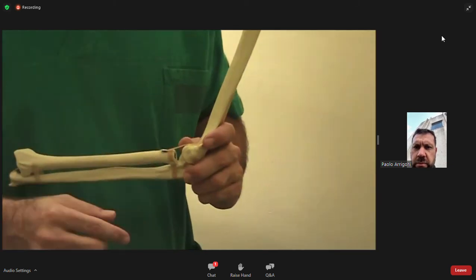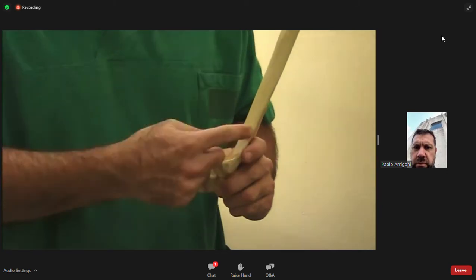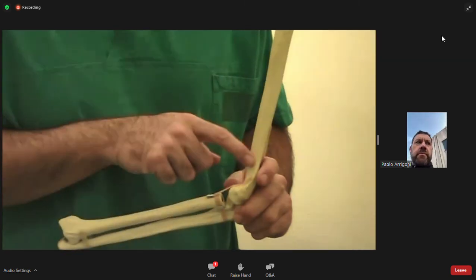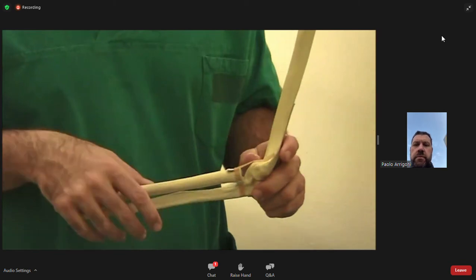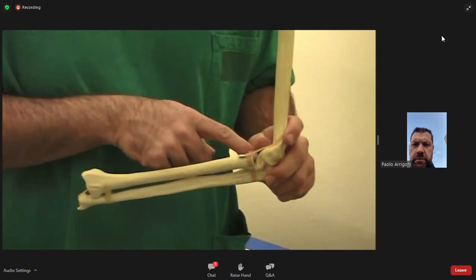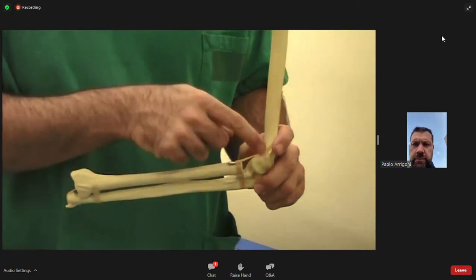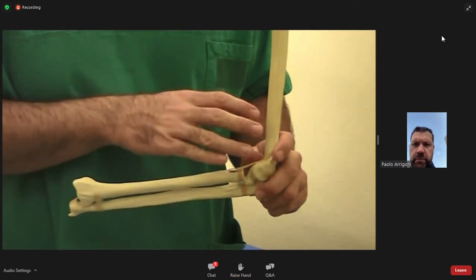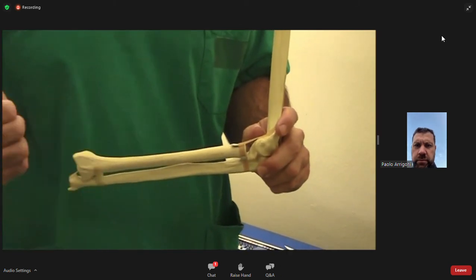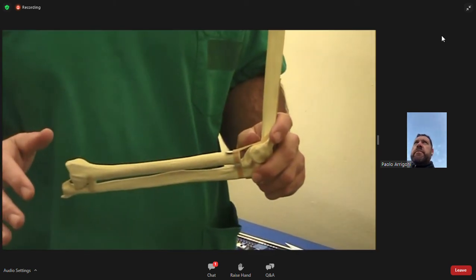I wouldn't be scared, and this is something I normally do in my practice, to go up following the humerus on the supracondylar region to detach the capsule here. The capsule here is not very important in terms of stability of the joint, but when you expose it and flex the joint a bit, you will see very nicely also the radial side of the ulna. So flex and expose the capsule here to obtain a lot of vision. Be certain to recognize if the LCL is torn or not, because if it's torn, you will have to reinsert it at the end of the procedure.